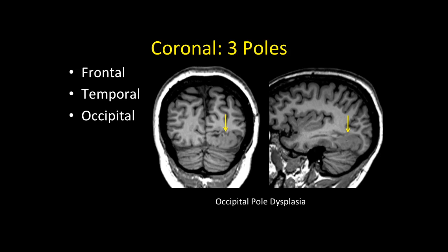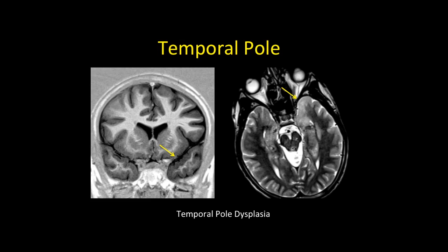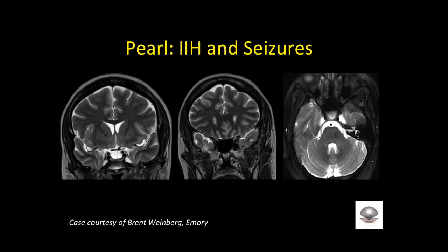On the coronal MP-rage, look at the three poles: the frontal pole, the temporal pole, and the occipital pole. Here's a case of occipital pole dysplasia, a subtle frontal pole dysplasia on the right, and a temporal pole dysplasia with blurring of the gray-white matter margin. Another pearl: if you see a flattened, expanded empty sella suggesting IIH, look for temporal pole encephaloceles as a seizure source, and also check the anterior cranial fossa orbital-frontal region where encephaloceles can breach into the orbit.